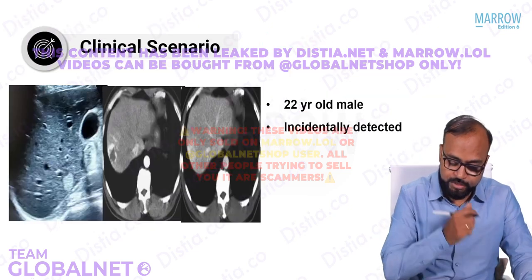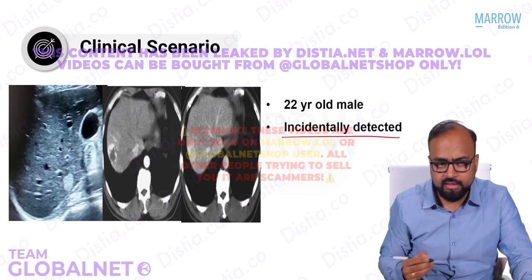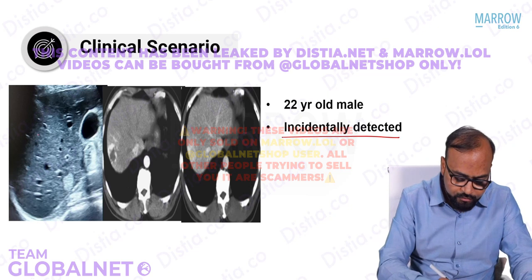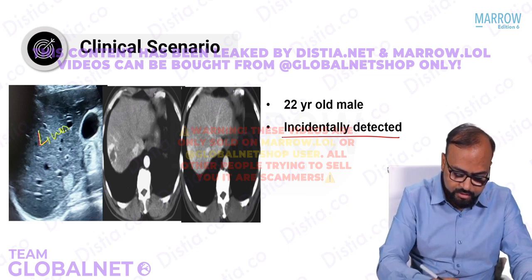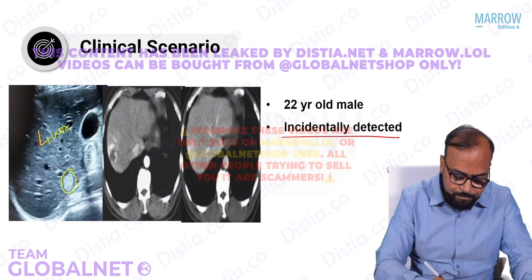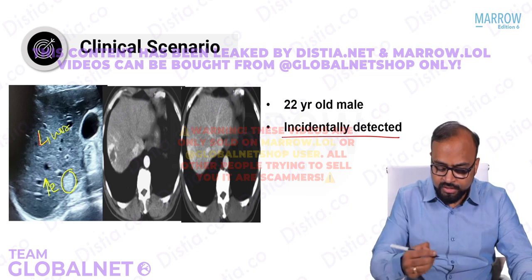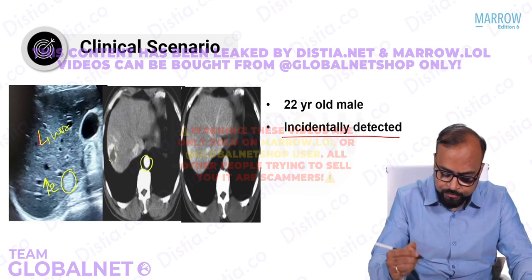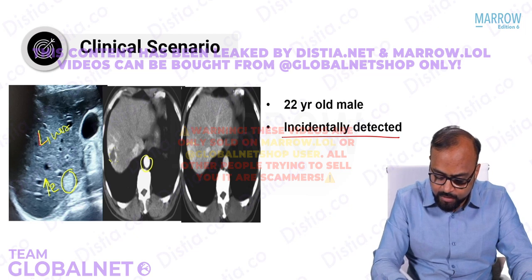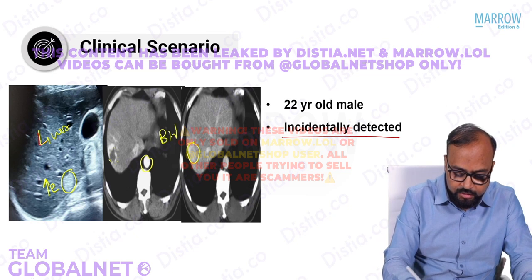Yes. Now see, a young male with an incidentally detected lesion. What do you see? Within the liver parenchyma here, you see a focal hyperechoic lesion. It is appearing bright. Now on contrast and on CT, look at the arterial phase, it shows peripheral early enhancement. Look at the delayed phase, it is almost completely filled up. So this is called as the blood pool enhancement.